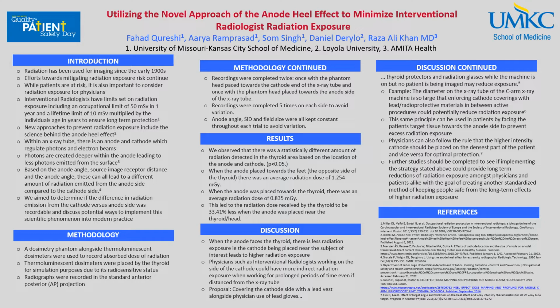For our methodology, a dosimetry phantom alongside thermoluminescent dosimeters was used to record absorbed doses of radiation. Thermoluminescent dosimeters were placed by the thyroid for simulation purposes due to its radiosensitive status. Radiographs were recorded in the standard anterior-posterior projection manner.